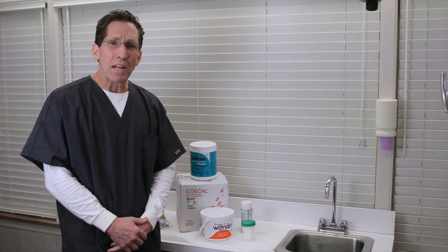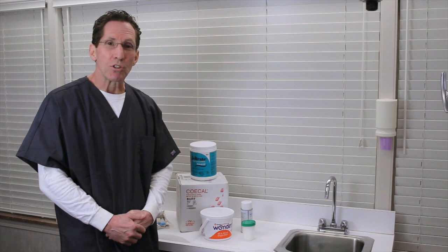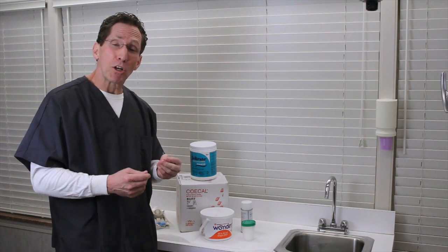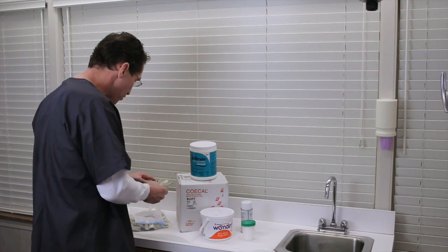Hi again. Before we get into our actual demonstrations of our procedures, I'd like to review with you some of the important materials that we're going to be using and demonstrating. And this is not a comprehensive list or demonstration, but it will show some of the important materials that we use. Now, first of all, we begin with our impression trays.